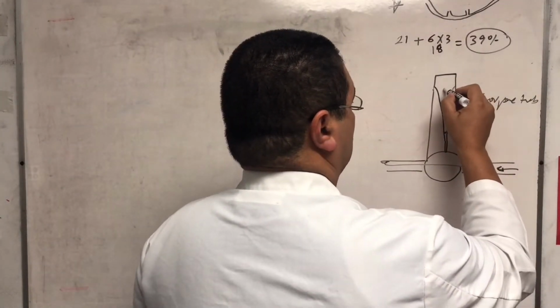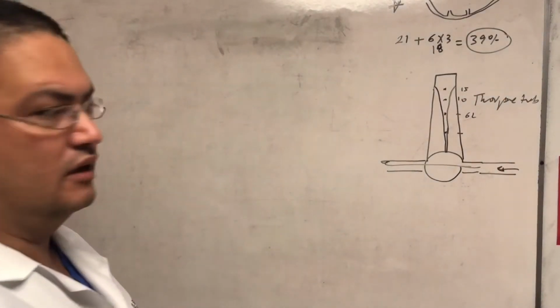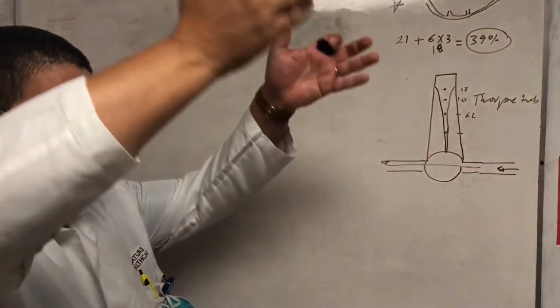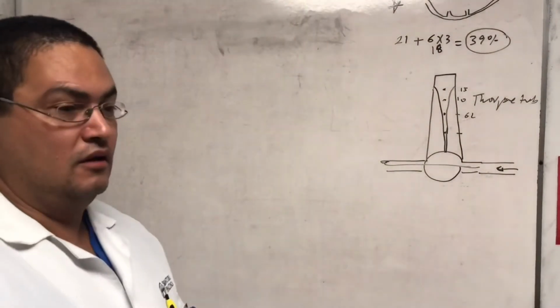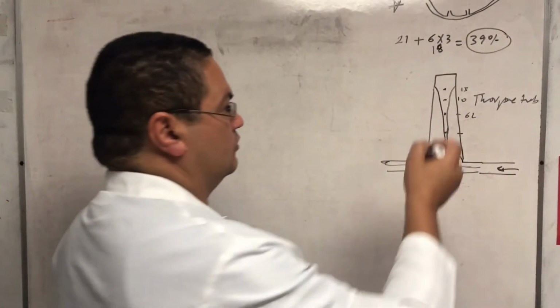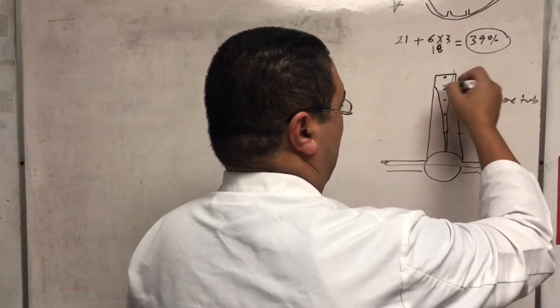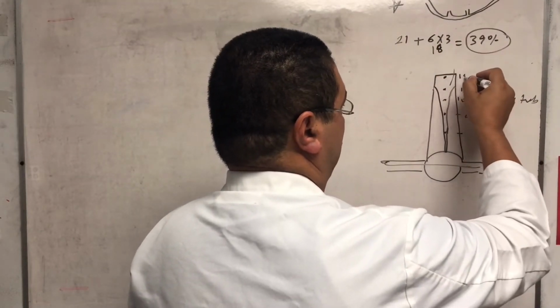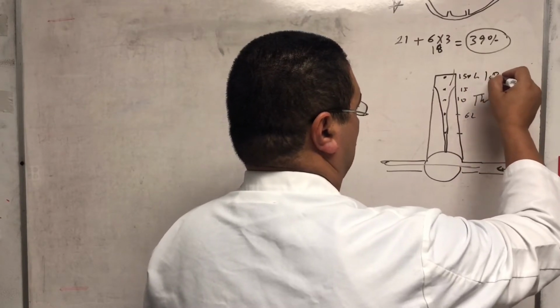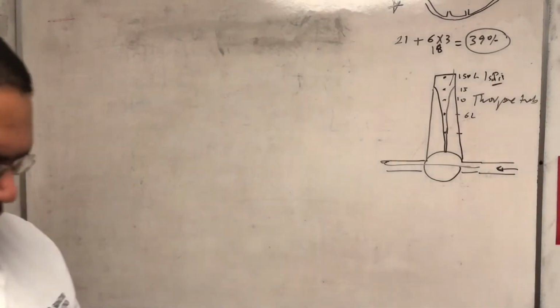If you want 15, it will be here. But above 15, they got tired of it. They said we're not gonna go graduated, the tube all the way to the ceiling. So we're gonna just play it open at the end. And if you want to keep the ball here, where there's a lot of escape of air around the ball, about 150 liters per minute, that's at 50 psi coming from the wall. And that gives you about 150 liters per minute.